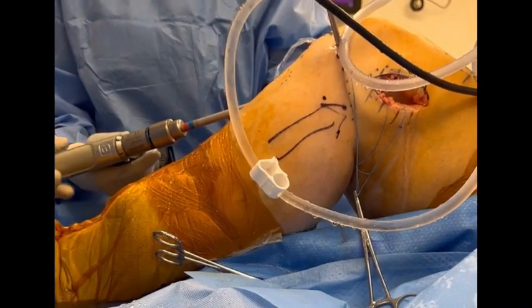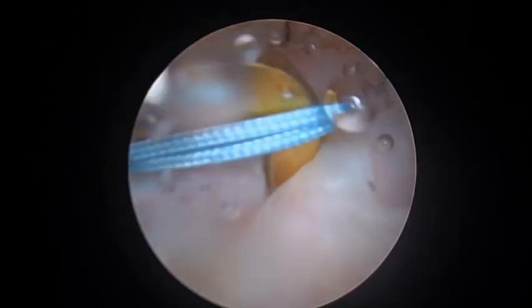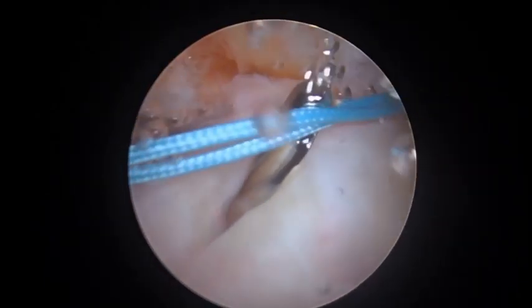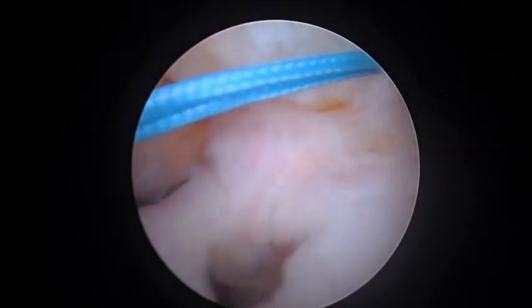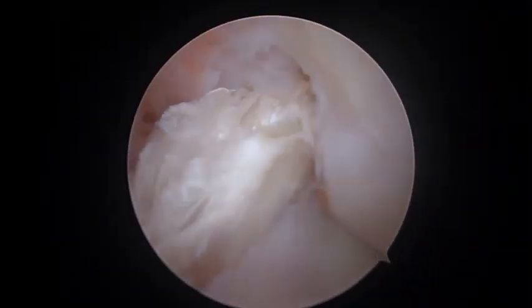Next, the tibial tunnel is created with a width of 9 mm and dilated to 10 mm in the anatomic footprint. The footprint is then prepared with the use of an arthroscopic shaver and is ready for graft passage. The graft is then passed transtibially.